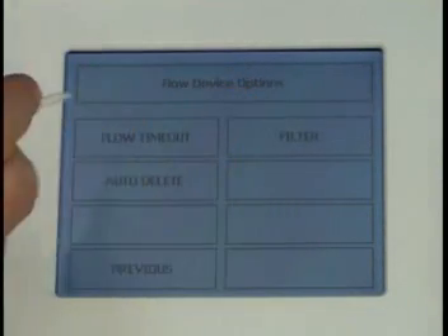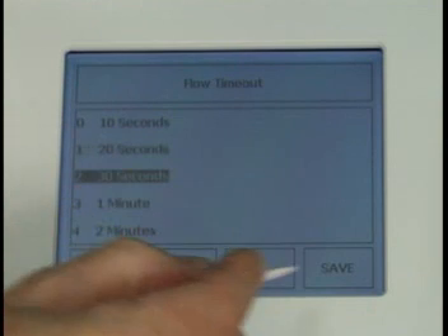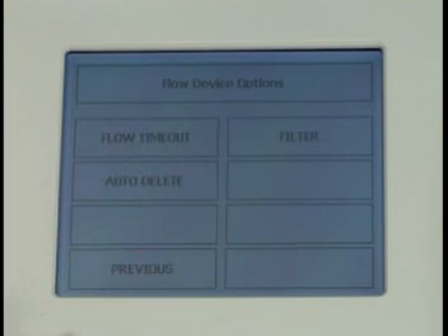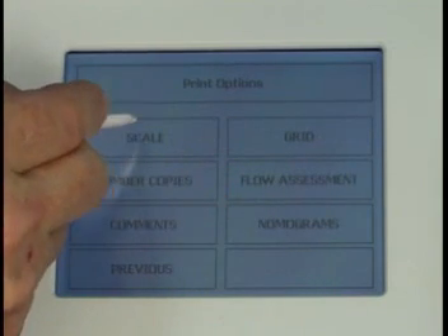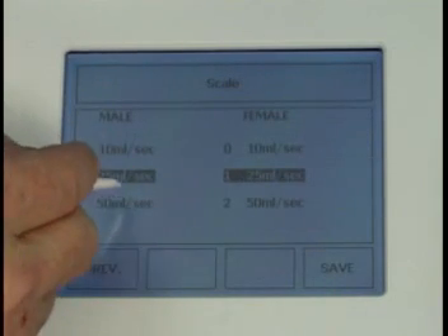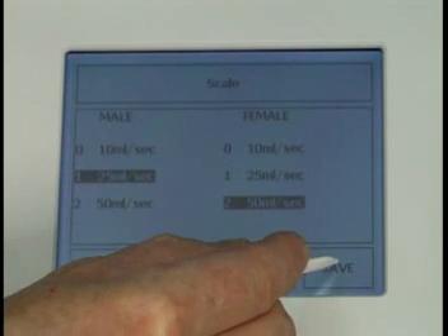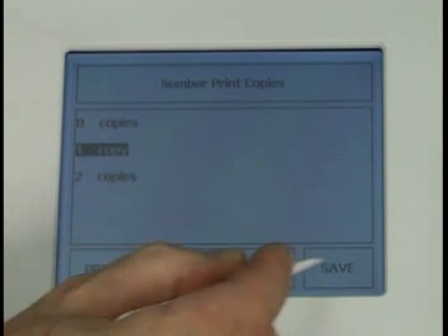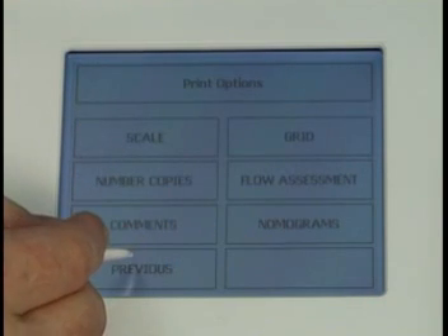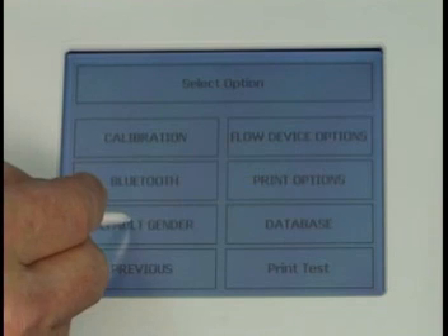Eurodyne Plus runs on battery. Configuration options include flow timeout, scaling, number of print copies, default gender, and more.